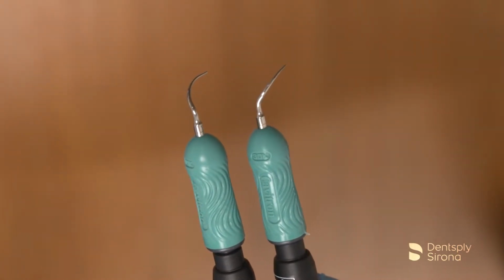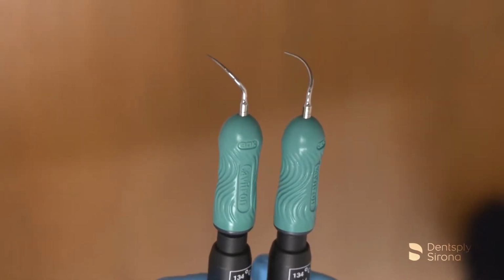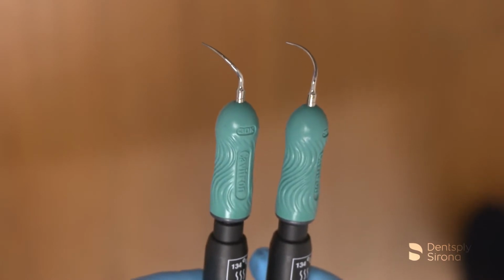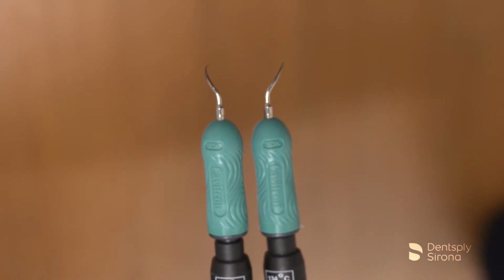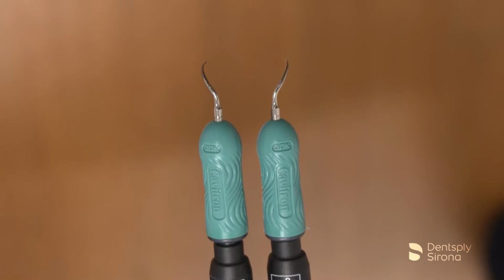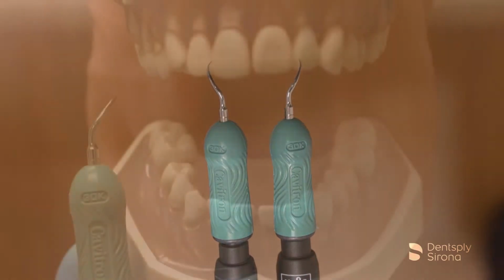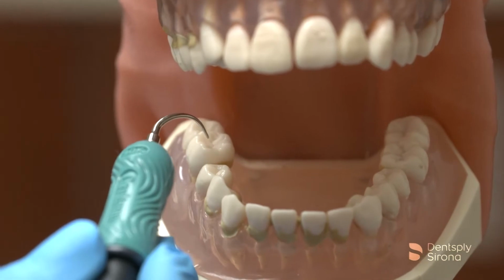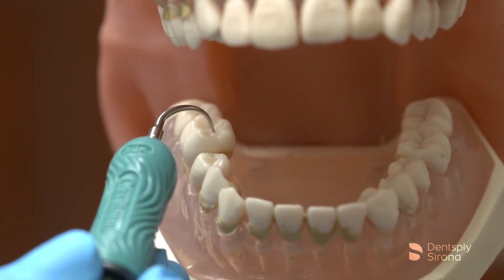Adapting the curved insert properly requires a fundamental knowledge of the tooth's anatomy and proper placement on the appropriate tooth surface. In order to identify which insert one is holding, it is recommended to begin by holding the inserts parallel to the floor with the points facing down or perpendicular to the floor with the points facing away from the clinician. The right insert will curve to the right and the left will curve to the left. It is also helpful to place the insert on the occlusal of the intended tooth, as demonstrated here, to see the curvature to ensure you selected the correct insert.